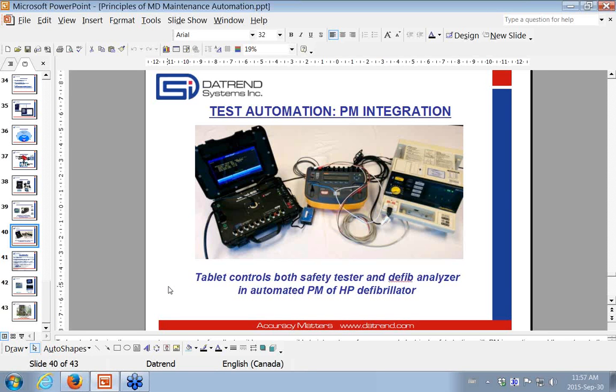Okay. Next question. How many procedures does the VPad hold? Well, this is the thing about procedures. Fortunately, they're documents. Now we can actually go into procedures that are based on video. We have the capability to do that. But for the most part, procedures are documents.